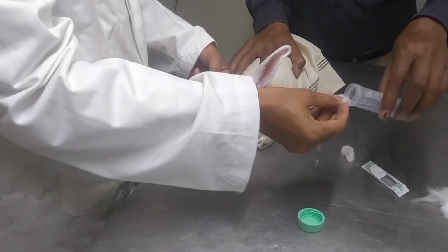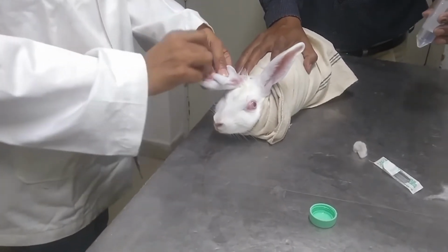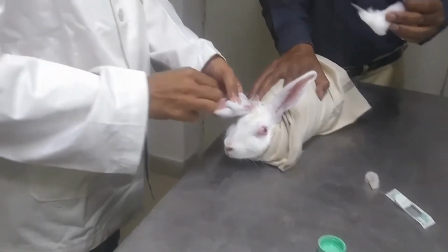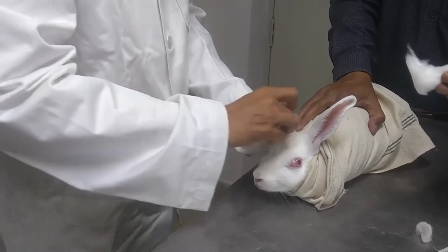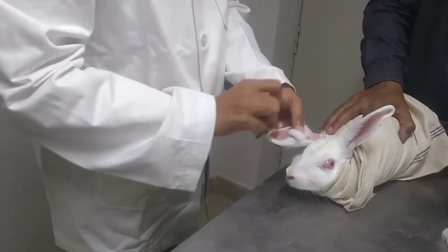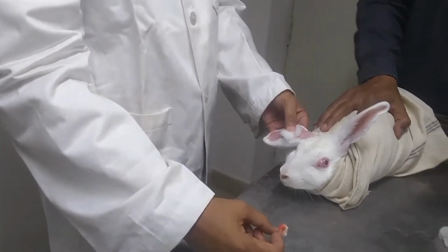Using sterile water, we wipe out all the blood here and there. If there is any spillage, we will wipe it all over using water so that the vein becomes cool and gets shrunk.